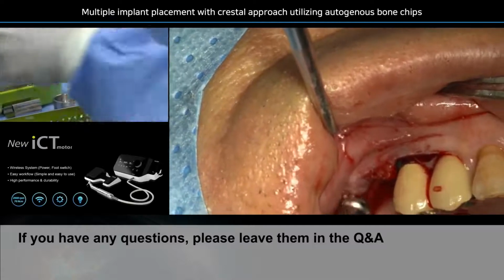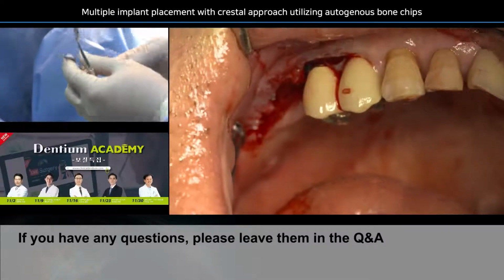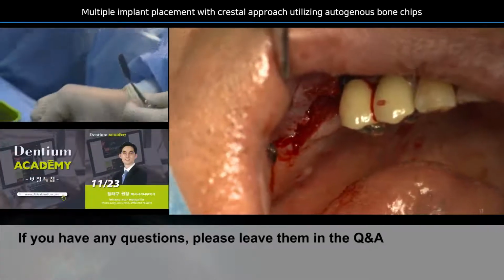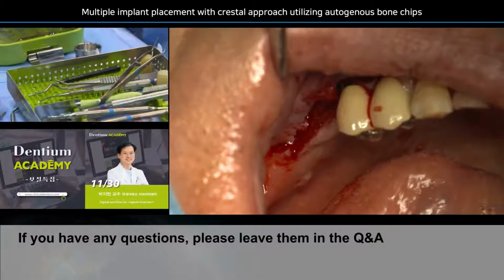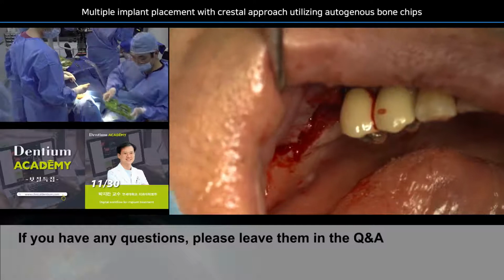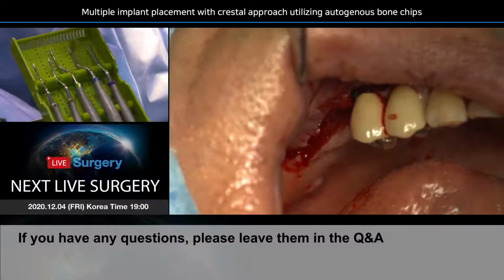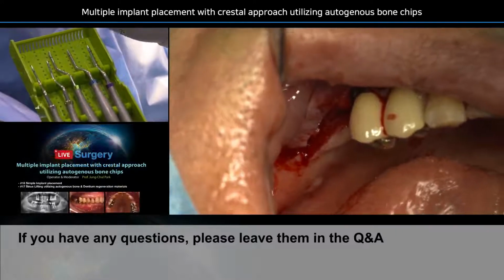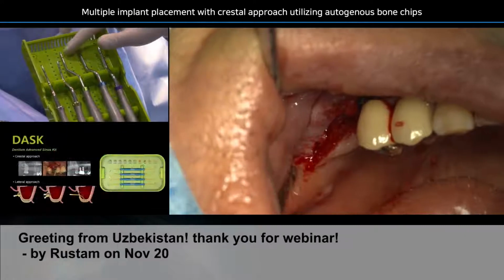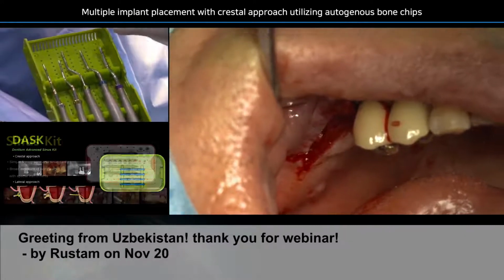And finally, I'm going to show you the osteotome technique. So this is the osteotome. 자, 그 컨벤셔널 오스티오톰 하나 보여주시고요. 네. So, this is the osteotome with a flat end, and we have the convex osteotome. But the bone-augmented osteotome technique requires this flat-ended osteotome. So we are going to use this tool today.